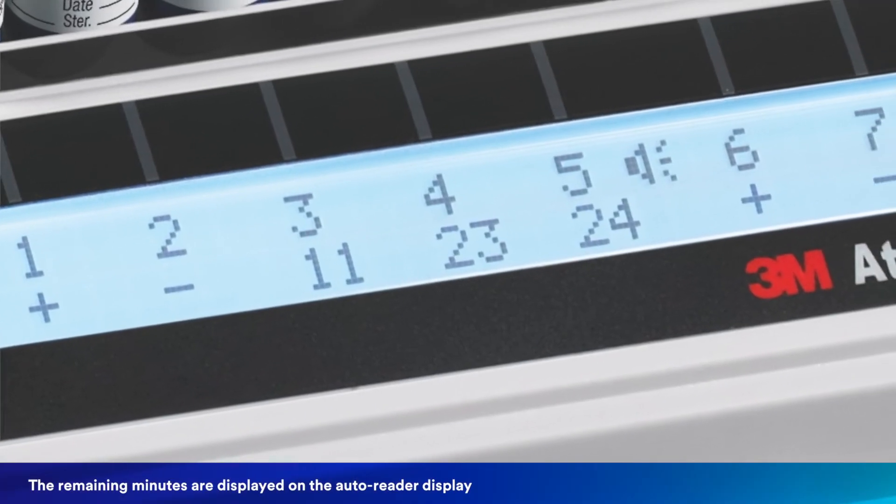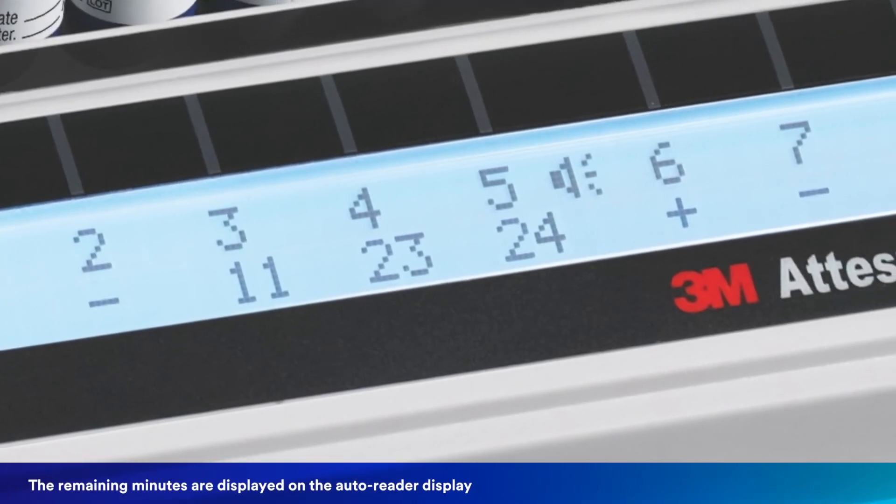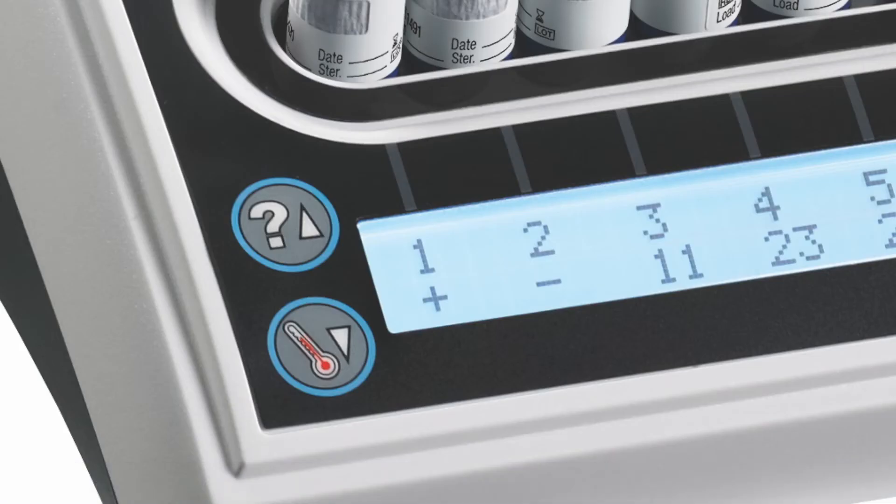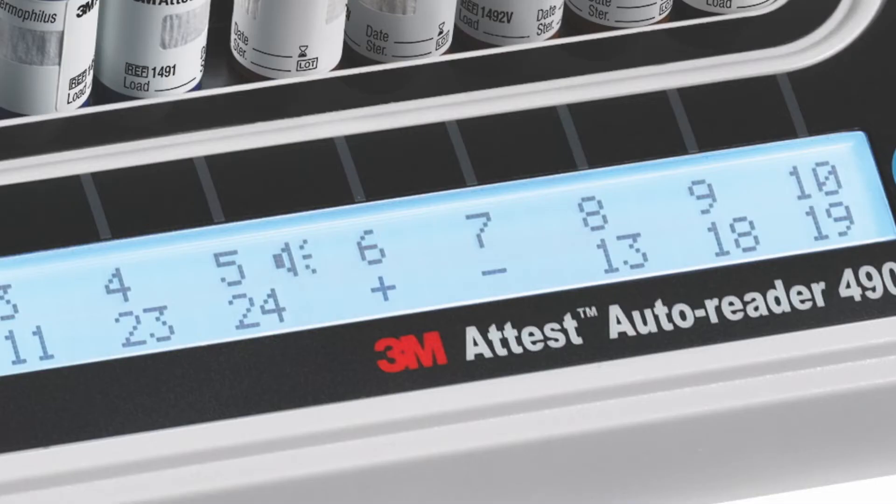The remaining minutes of incubation are displayed on the Autoreader display. Do not remove the BI until a positive or negative symbol under the BI indicates that the test is complete. Each day that a test BI is incubated, a control BI that is unprocessed from the same lot number should also be activated and incubated.